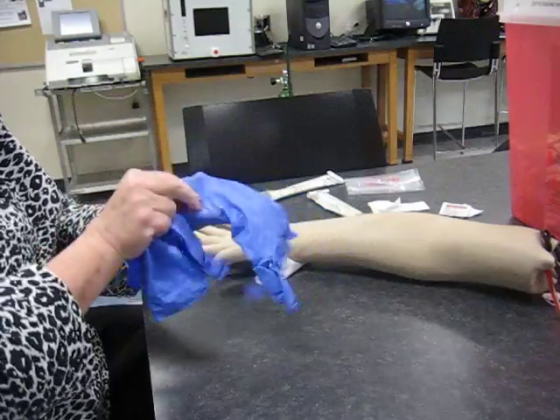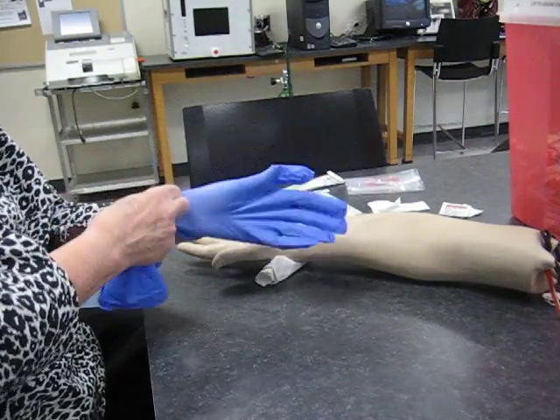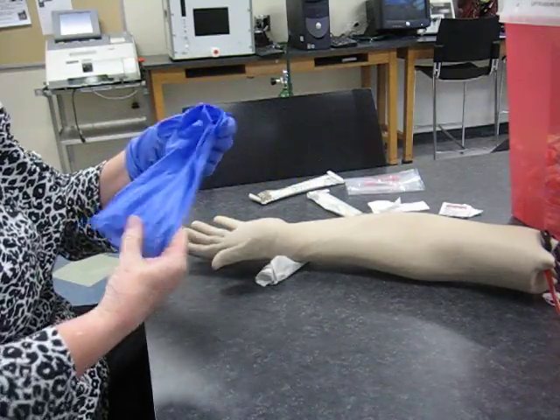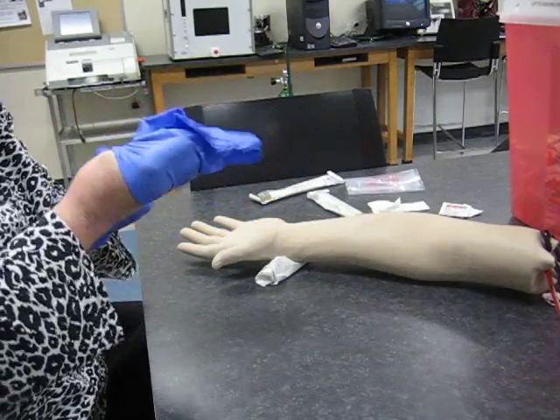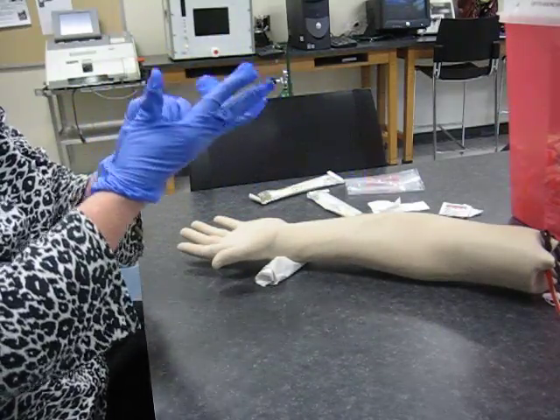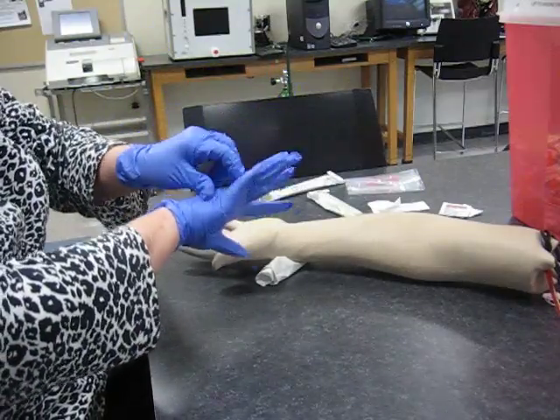Just before I pick the needle up, if I've touched a lot of things in between, I go ahead and wash my hands again — it's usually a good idea to wash your hands again and then put the gloves on just before the needle. I like to have small gloves, these are labeled small but my fingers don't fit real tight. I like to have them tight across my fingers because it makes my fingertips more sensitive.